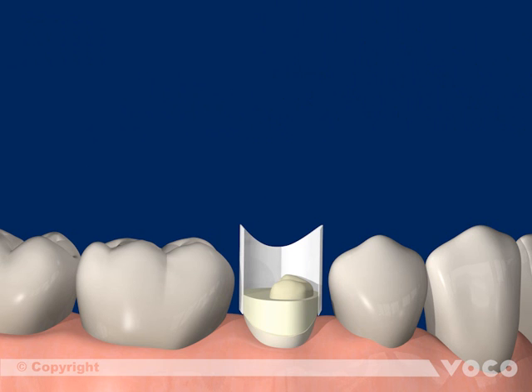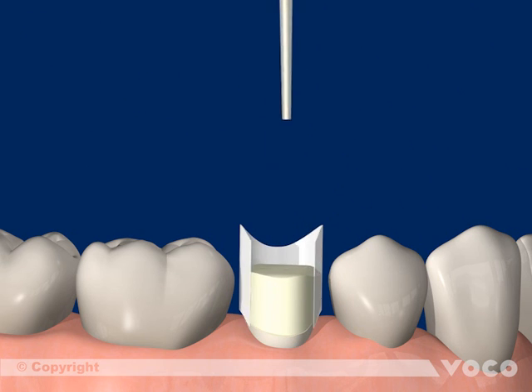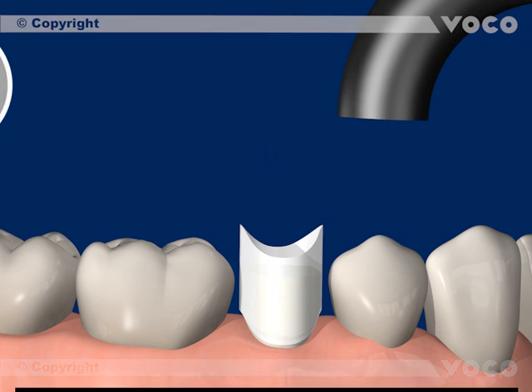As an alternative, the self-curing mechanism of the material can be used by filling in the matrix and waiting for 5 minutes until the chemical curing is finished.